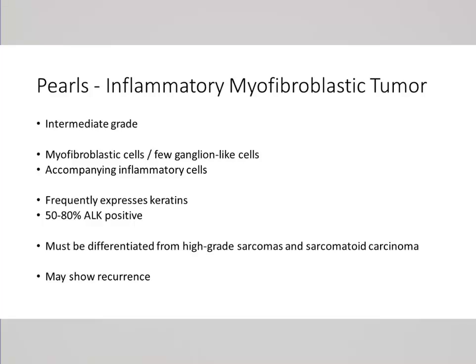The importance of these cases is that IMTs may express cytokeratins, which creates an important and essential differential diagnosis pitfall with the sarcomatoid carcinomas.